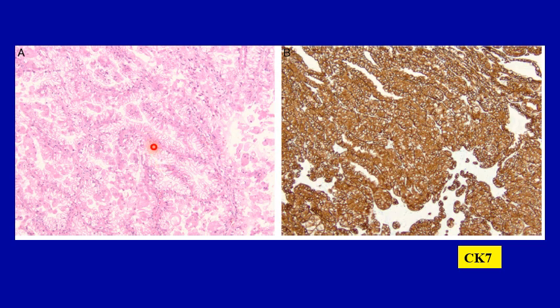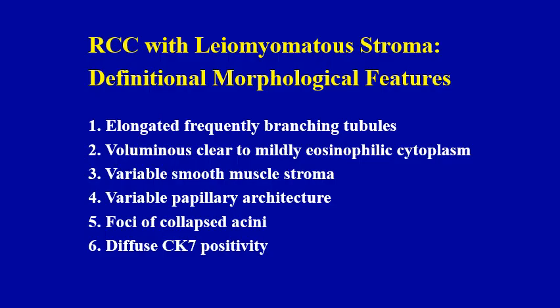Here is another example showing the nice feature of voluminous clear to mildly eosinophilic cytoplasm and the presence of diffuse CK-7 expression. This slide summarizes the definitional morphological features to keep in mind. These are not obvious but are definitely very important, and even though they appear subtle, when applied along with the diffuse CK-7 expression pattern, they often lead you to the correct diagnosis: elongated frequently branching tubules, voluminous clear to mildly eosinophilic cytoplasm, variable smooth muscle stroma, variable papillary architecture, foci of collapsed acini, and diffuse CK-7 positivity.